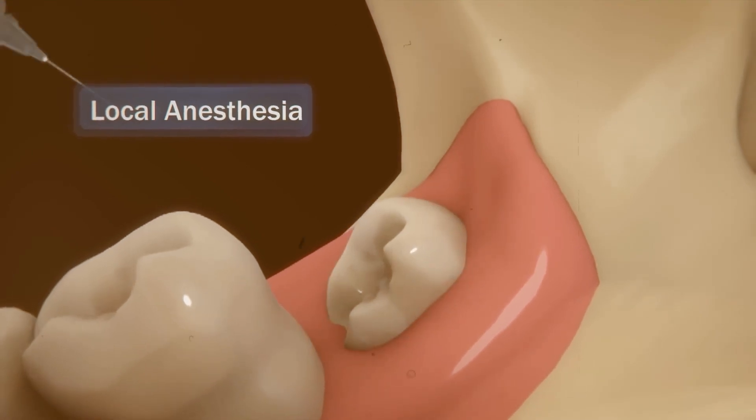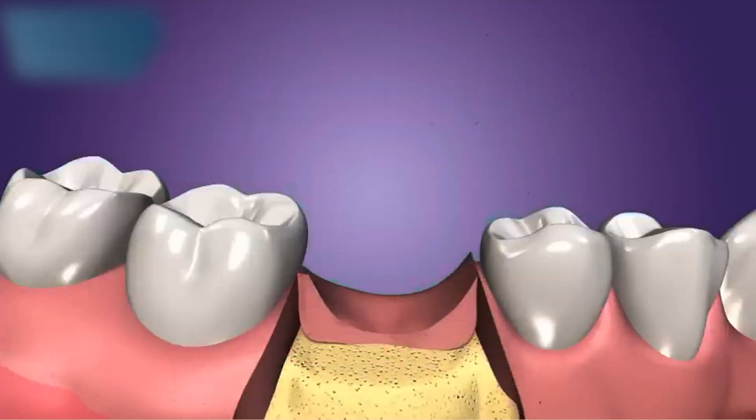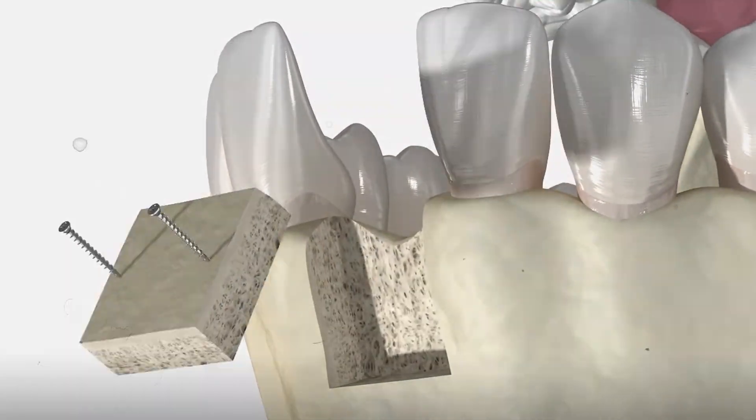For a jawbone graft, the doctor first numbs your gums with local anesthesia. Then, they make an incision in your gums to expose the underlying jawbone. Next, the weak bone is carefully cut and removed, and a piece of stronger bone is patched into its place.